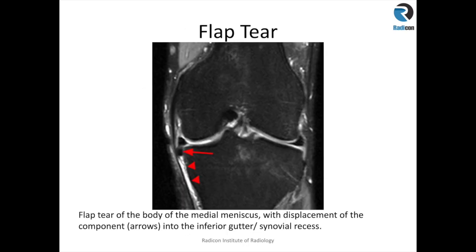Here is an example of a flap tear of the body of the medial meniscus. You can see a rounded low signal intensity structure along the border of the medial tibial condyle, deep to the MCL. The MCL runs down as a black low signal intensity structure, and this displaced fragment — which should not be there — confirms a flap tear of the body of the medial meniscus.